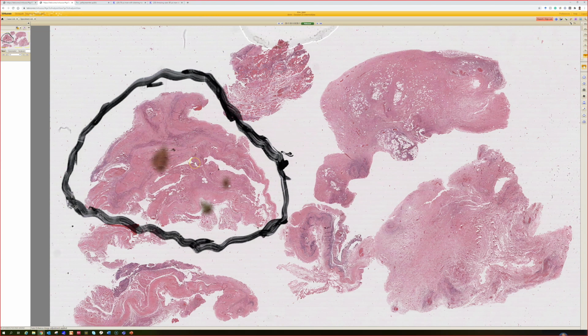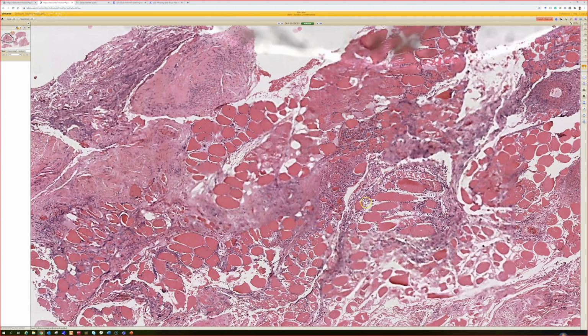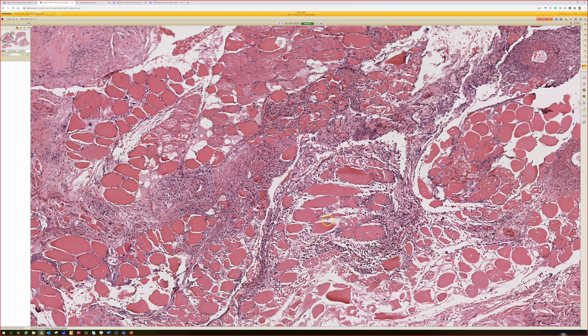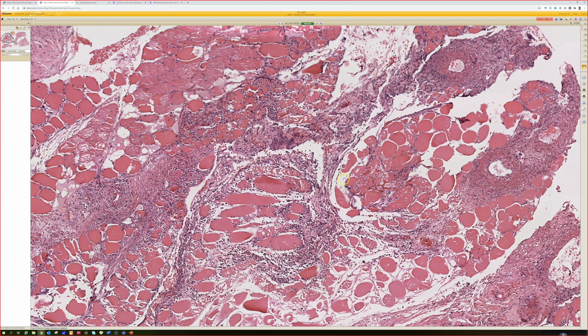And then there is some inflammation, and it looked mainly neutrophilic. I think we have some in here. So putting those two things together, I was thinking of necrotizing fasciitis, something that could cause inflammation that deep down. Excellent. Yeah, that is exactly what this is. And necrotizing fasciitis is a really serious disease that requires quick clinical intervention, often extensive surgical debridement in addition to antibiotics. One big problem, which happens more on the clinical than the path side, is that pyoderma gangrenosum is often misdiagnosed clinically as necrotizing fasciitis.